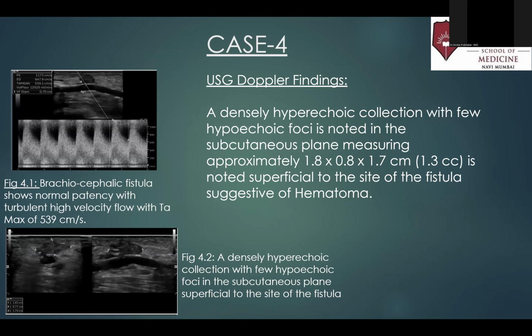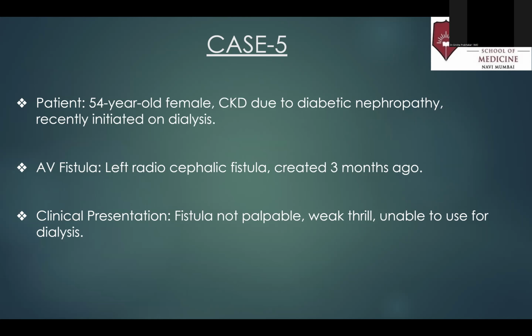This hematoma was not significant enough to cause compression of the underlying vessels, but this is one of the complications of AV fistulas, post-fistula hematoma formation. The fifth case was a 54-year-old female, CKD due to diabetic nephropathy, recently initiated on dialysis, with a left radiocephalic fistula created 3 months ago.